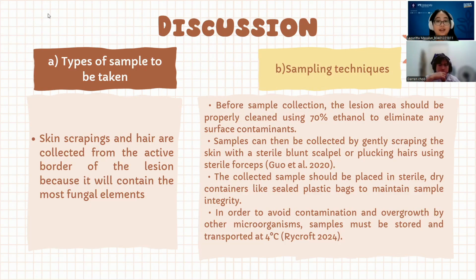2020. Then the collected sample should be placed in sterile dry containers like a sealed plastic bag to maintain the sample integrity. In order to avoid contamination and overgrowth by other microorganisms, the sample must be stored and transported at 4 degrees Celsius.